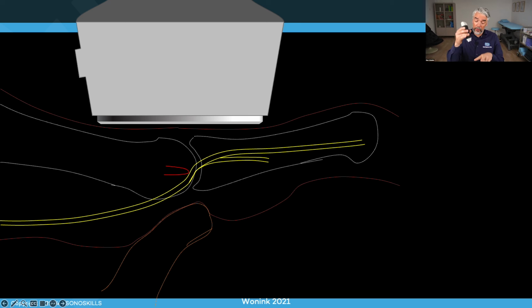We're going to place the transducer in the middle of these metatarsal bones, shooting medial to the third metatarsal bone, shooting to the fourth metatarsal bone, and then placing the transducer really in the middle, so that we are really certain that we are scanning the correct place.